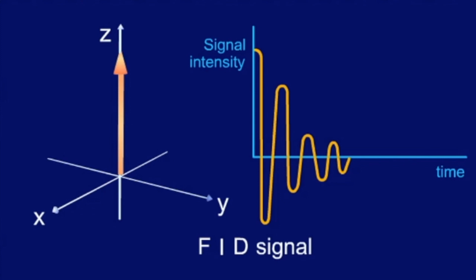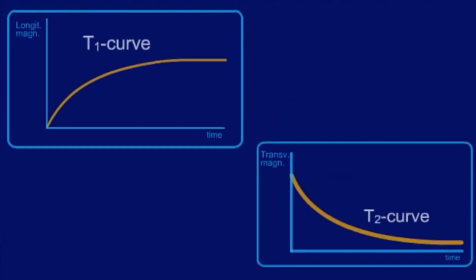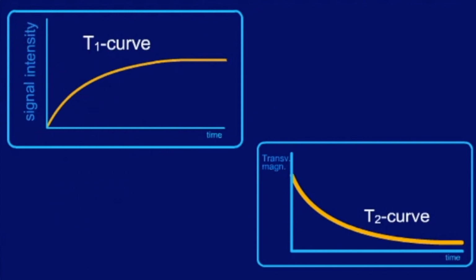By now, it should be obvious that the magnetic vectors directly determine the MRI signal and signal intensity by inducing electric currents in the antenna. Instead of the terms longitudinal or transversal magnetization, we can also use the term signal or signal intensity at the axis of our T1 and T2 curves.